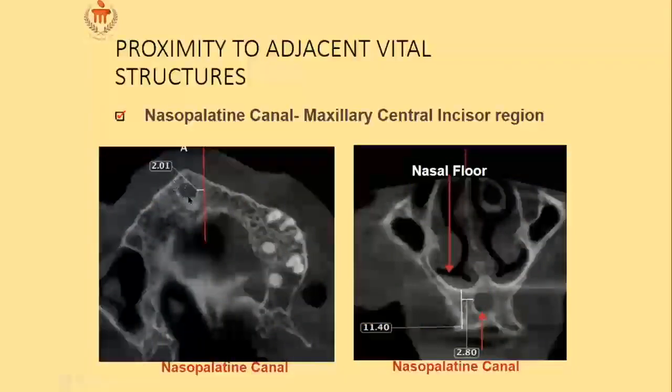See, this is the guy. This is where the implant site is planned. The distance is about 2 mm, right? So this is what you need to understand about the anatomy and say, okay, now I have 2 mm there. Can I use this place?